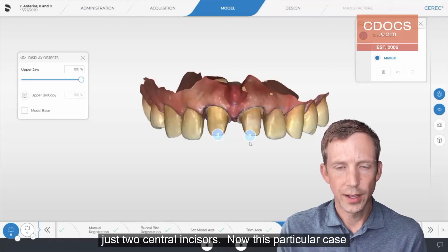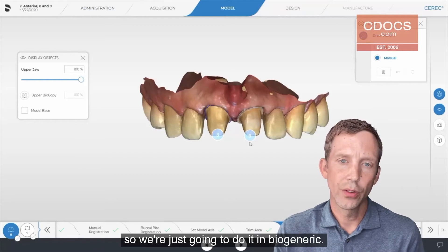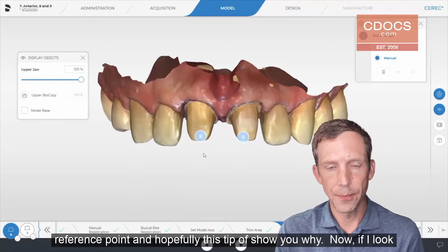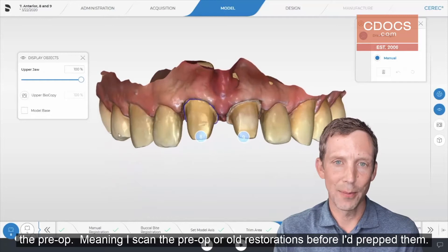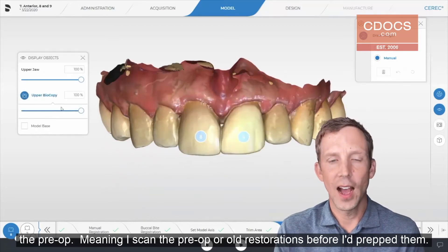Just two central incisors. This particular case, we did not have clinical time to do a diagnostic wax-up, so we're just going to do it in biogeneric. However, when you do central incisors in biogeneric, you still need a reference point, and hopefully this tip will show you why. If I look at tooth number 8 and 9, and I put up my biocopy, which in this case is the pre-op, meaning I scanned the pre-op or old restorations before I prepped them.